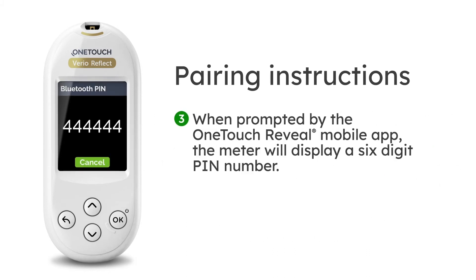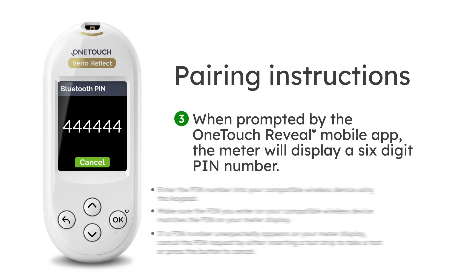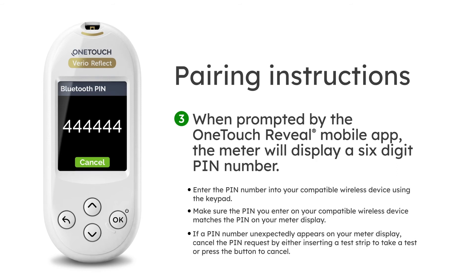Step 3: When prompted by the OneTouch Reveal mobile app, the meter will display a six-digit pin number. Enter the pin number into your compatible wireless device using the keypad.